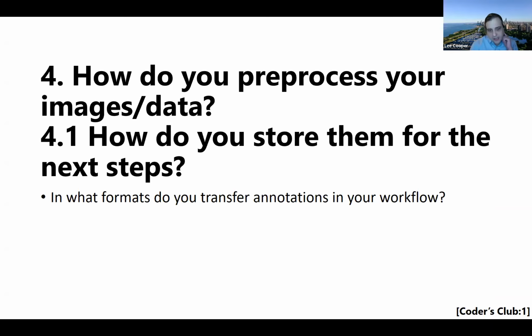I would say be very careful about intermediate formats, right? So, when things get stored in an SVS or NDPI, JPEG compression has been applied. If you want to generate some intermediate representation, tiles or something like that, if you apply lossy compression again, you can really introduce artifacts, right? And so you have an option of either paying that cost or storing it in a lossless format where you're going to really take a single slide and blow it up to like 30 gigabytes, right? So, just be careful how compression is applied. If you're transcoding, that works okay, but it's also very difficult to do.